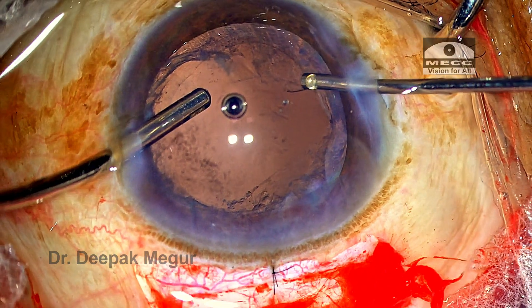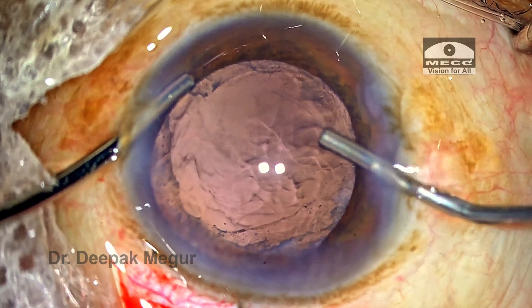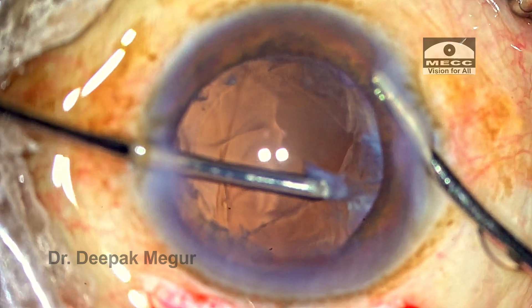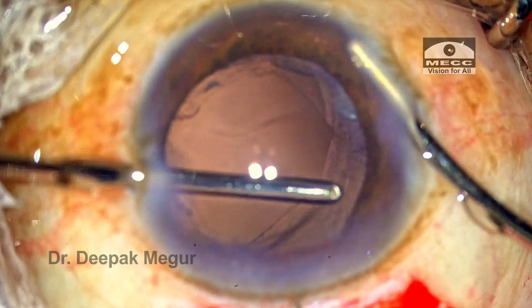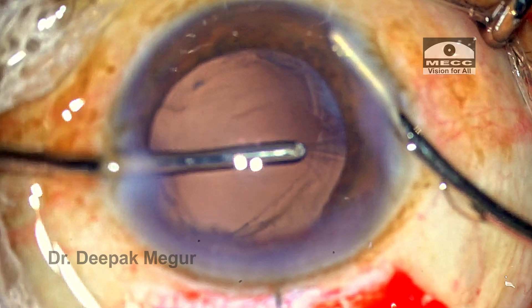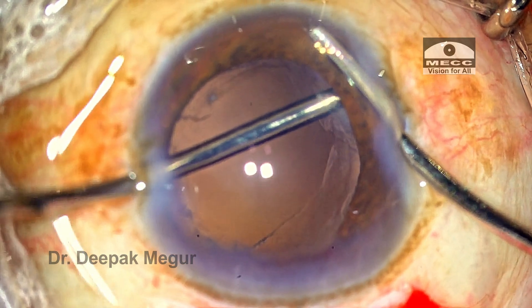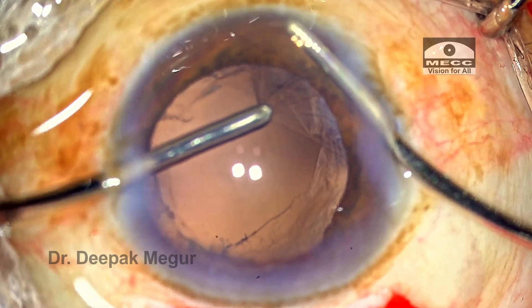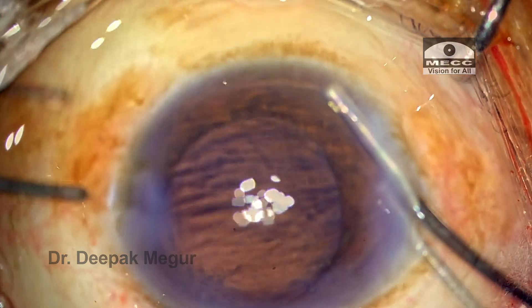The surgeon is now pretty sure that the vitreous is taken care of. Before coming out, viscoelastic is injected into the eye, and now is the time to remove the remaining cortex using the bimanual I&A system. The cortex is gently held, stripped out of the bag, and aspirated. The extent of the PC tear is quite large, and the surgeon is a little gingerly trying to pull out the cortex since she's not sure whether it's cortex or vitreous. Whenever there is doubt, always go back with the cutter and perform vitrectomy. There is also a risk that the rhexis margin can get compromised when cutting peripheral vitreous.